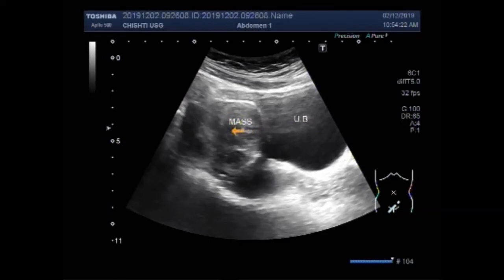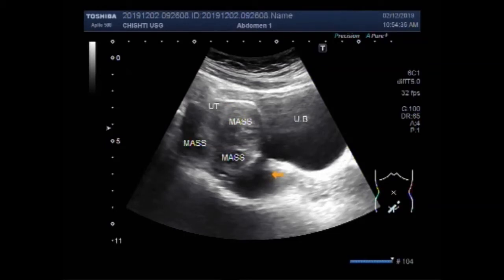This is a mass, this one is also a fibroid — these are the multiple fibroids seen in the middle and distal portion of the uterus. This is the cervix, and this is the urinary bladder.